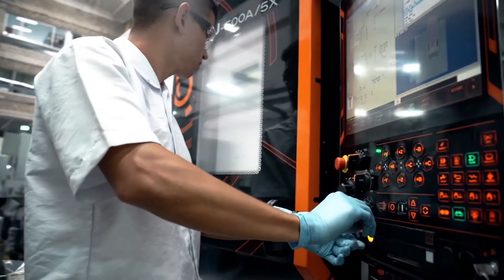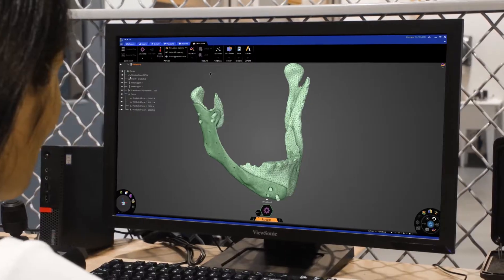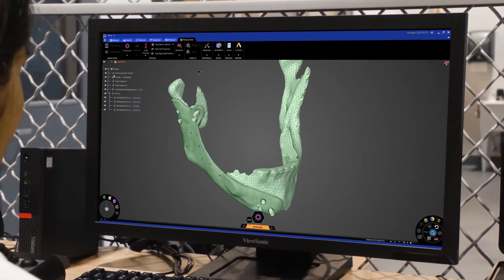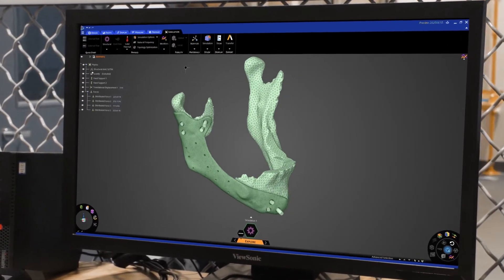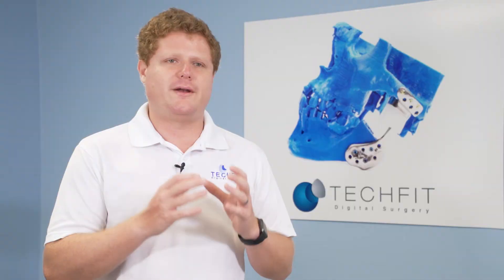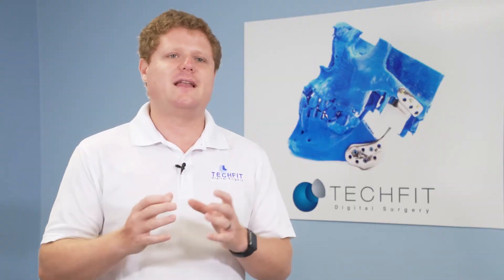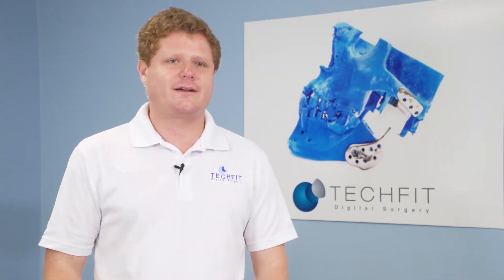In the data phase, we start with the patient's imaging files — the CT and the MRI — and we convert it into a 3D model that we can then use for engineering.